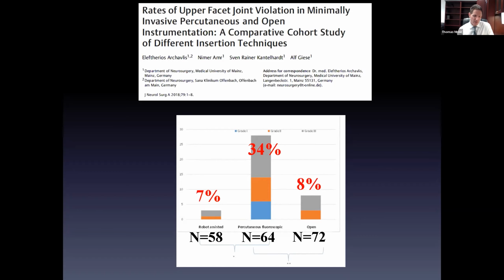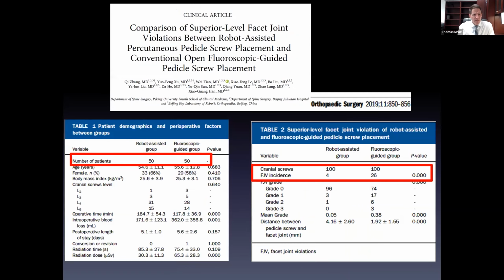When I used to place these with fluoroscopic guidance, I would have an AP in one plane at the same time. And so if you're going between AP and lateral, it introduces the possibility that you're going to make a mistake with regard to your placement as a potential reason.